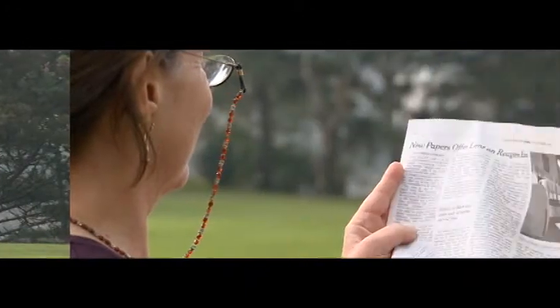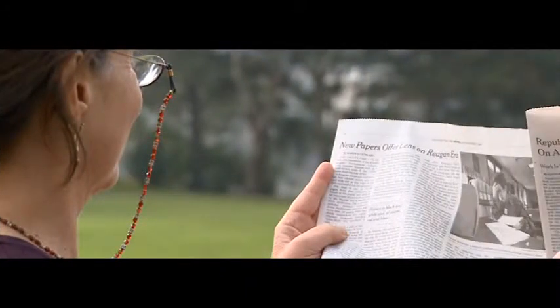If you choose to have a traditional monofocal lens implanted after cataract surgery, you can expect to see well at all distances when you're wearing the appropriate glasses. However, when you're not wearing glasses, your natural focus will be best at only one of the three ranges: far, intermediate, or near. You and your doctor will decide what distance is best for you. With a monofocal IOL set for distance, you will need to wear reading glasses for close-up vision.